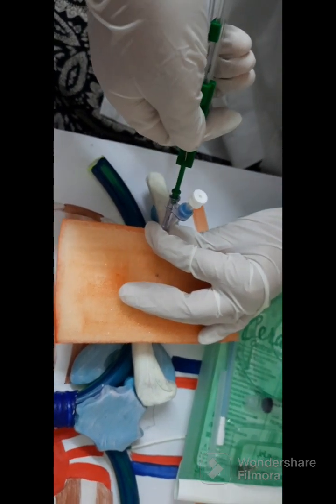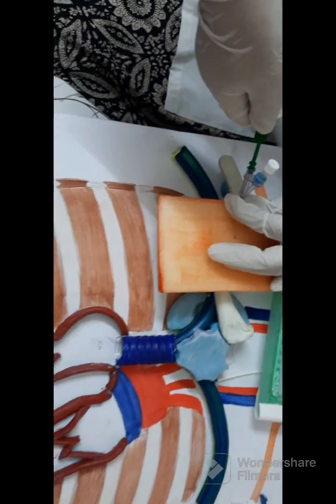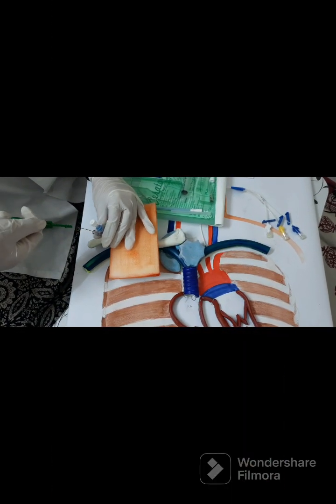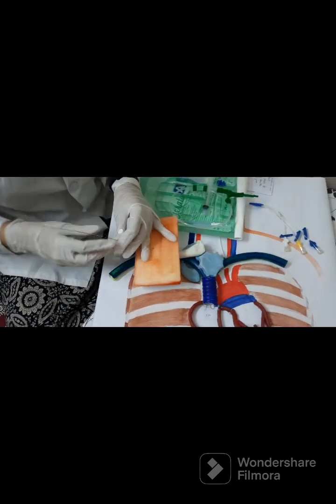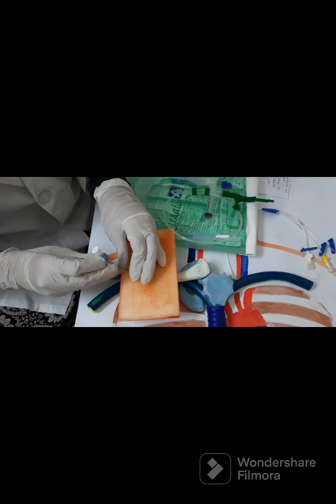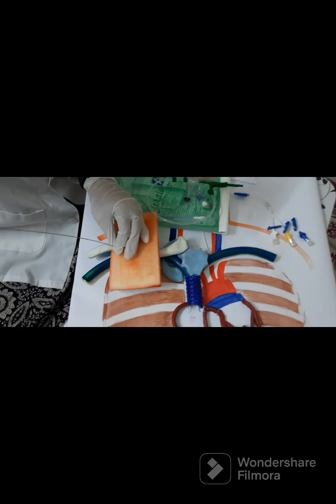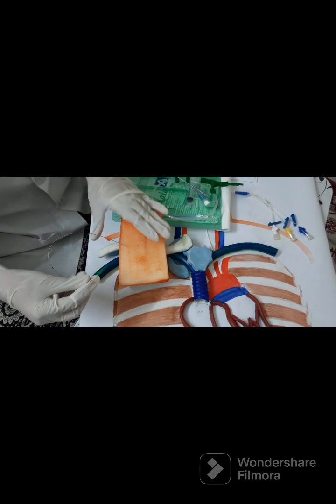Then we will keep holding this wire and remove the needle. We'll make sure that this wire stays in the vein.